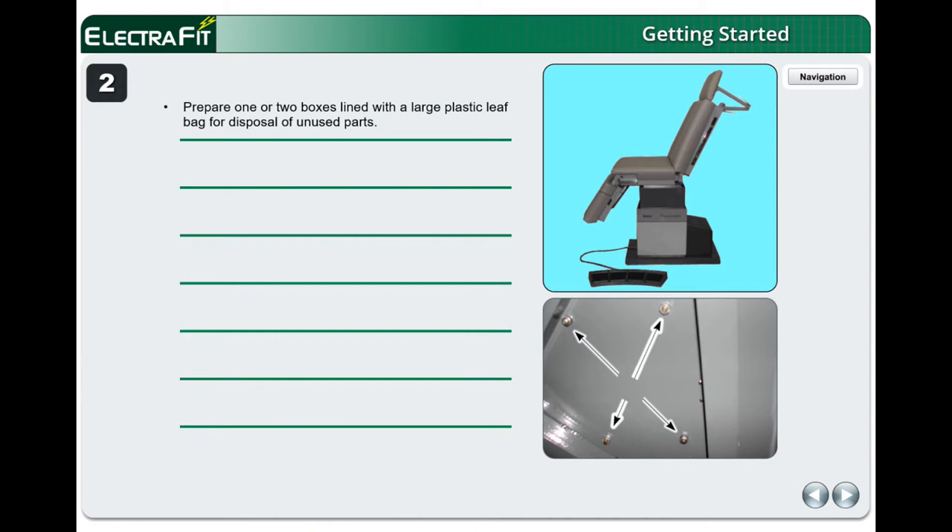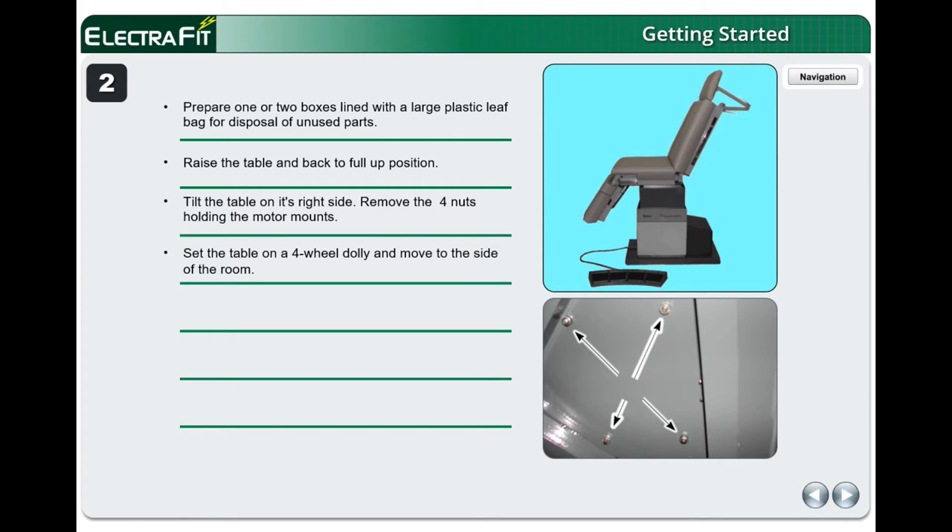Prepare one or two boxes lined with a large plastic leaf bag for disposal of unused parts. Raise the table and back to full-up position. Tilt the table on its right side and remove the four nuts holding the motor mounts. Set the table on a four-wheel dolly and move to the side of the room. Clean up the floor where the table was sitting.